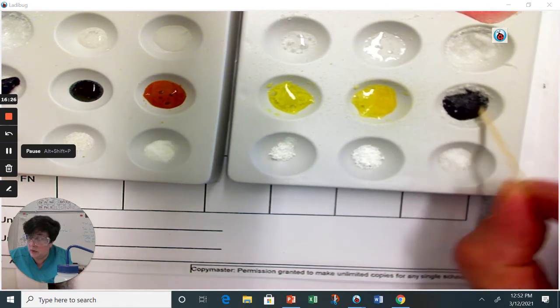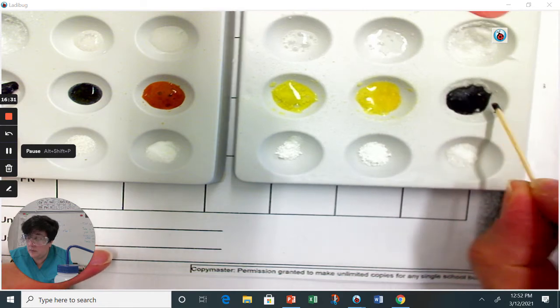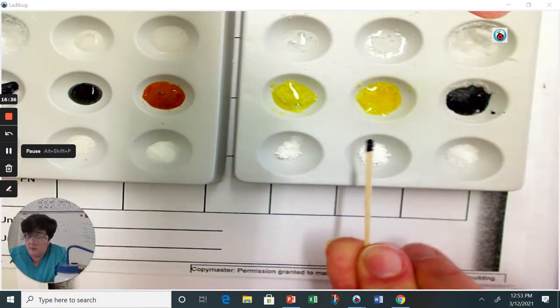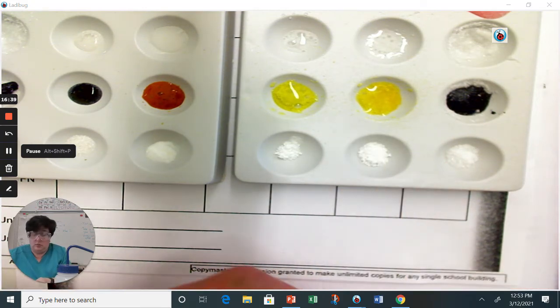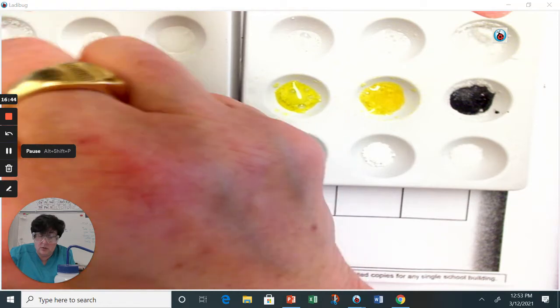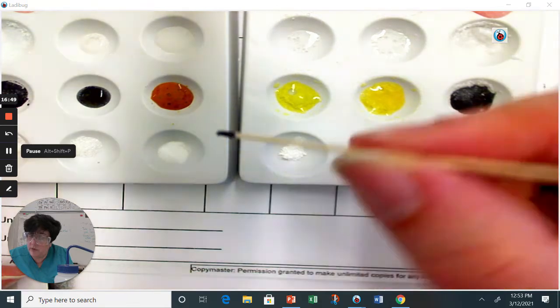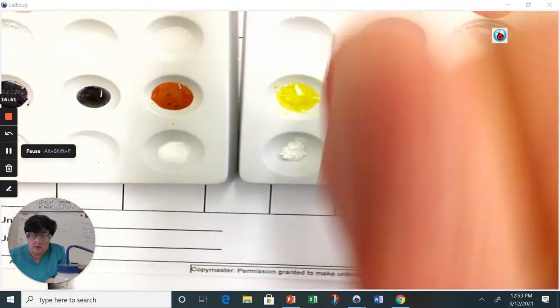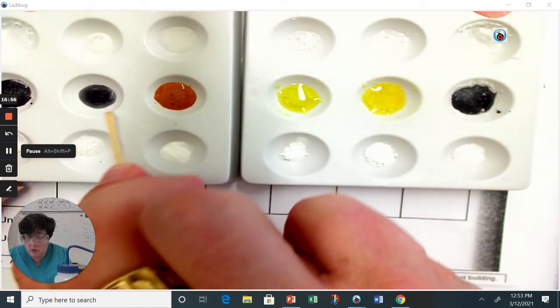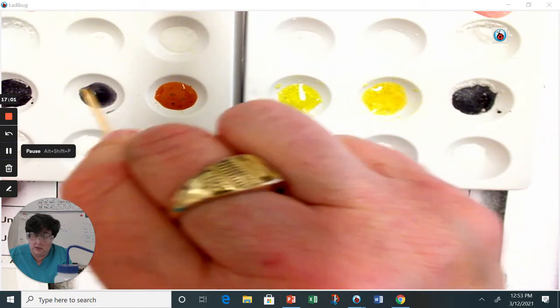And then I'll go back to the acetaminophen and the aspirin and stir it. See, I don't know if you can see that color there. That is a deep purple. I flipped over my little toothpick. Again, very similar, but let's see what my acetaminophen does. Oh, see, even though the solution is colored, it's really not turning this color once I stir it.